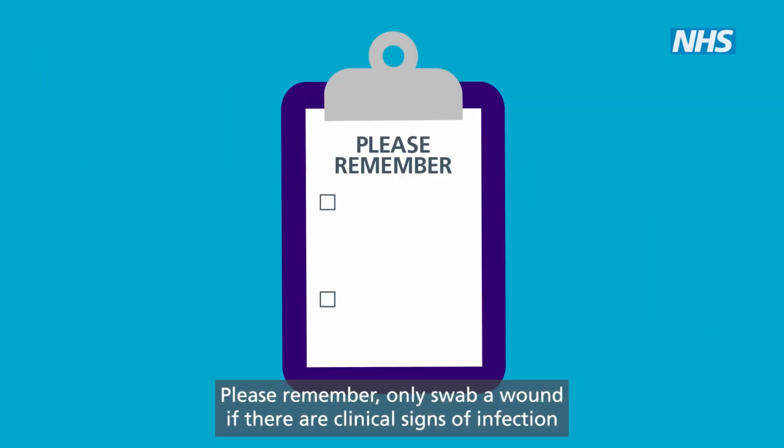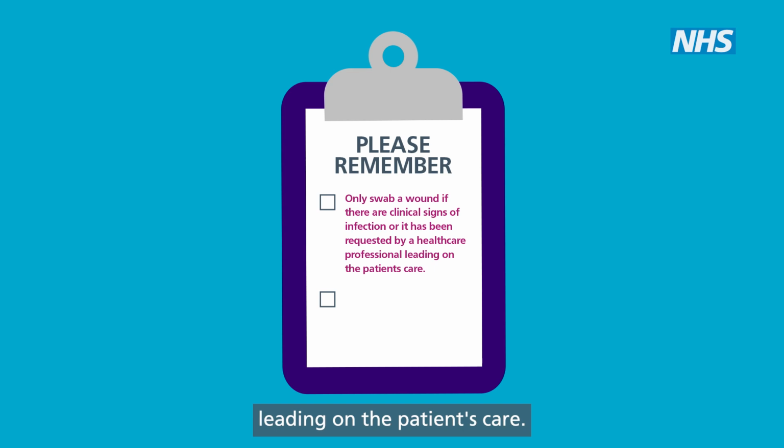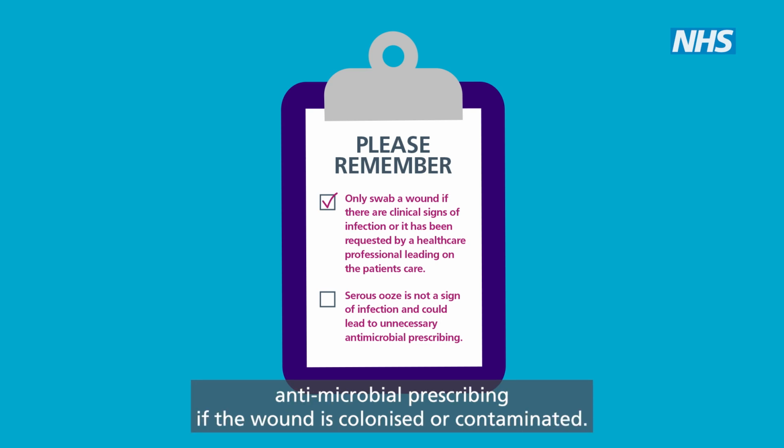Please remember, only swab a wound if there are clinical signs of infection or it has been requested by a healthcare professional leading on the patient's care. Serous ooze is not a sign of infection and could lead to unnecessary antimicrobial prescribing if the wound is colonized or contaminated.